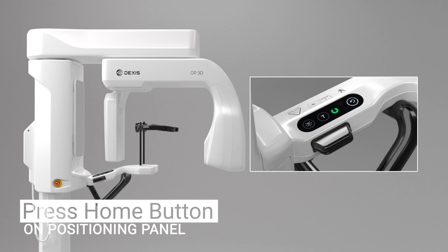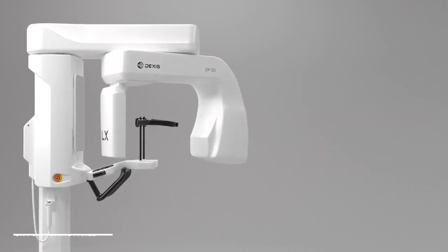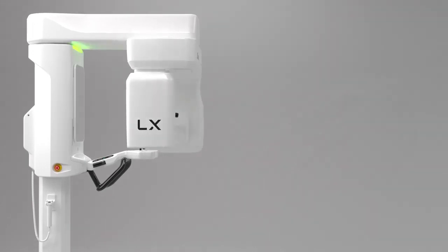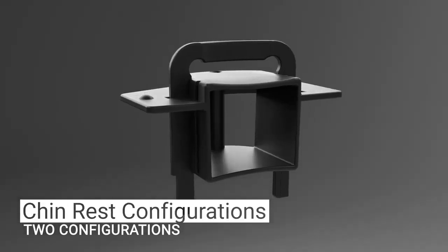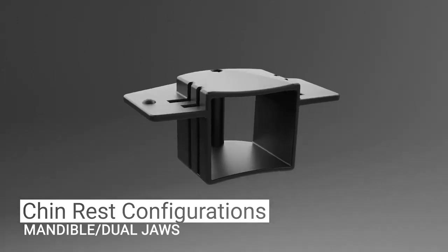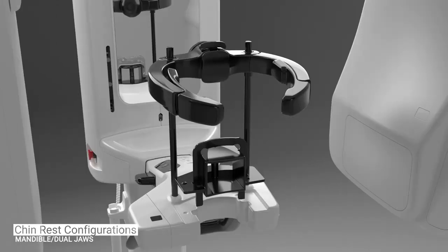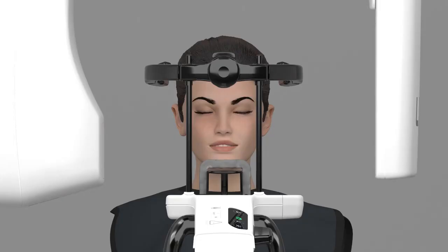Press the Home button on the OP3D LX control panel. The unit will move to the Home Patient in position. There are two chin rest configurations used when acquiring a 3D image. One for the maxilla and one for the mandible or dual jaws. With the chin rest pre-configured, place it onto the lower shelf of the device. It is also possible to acquire a 15 by 20 image without the use of the chin rest.